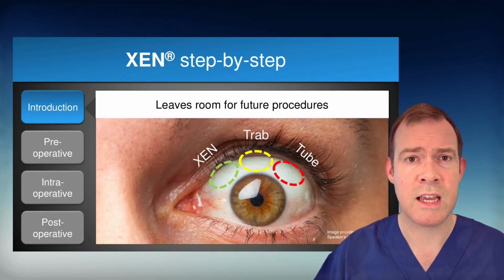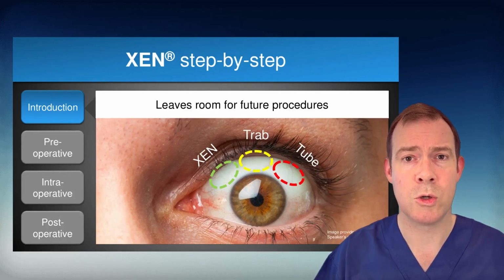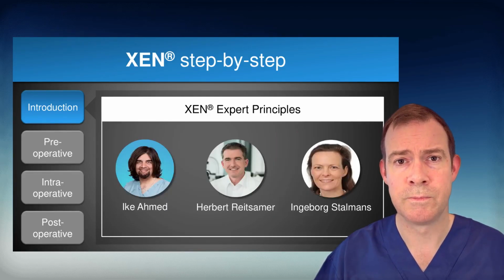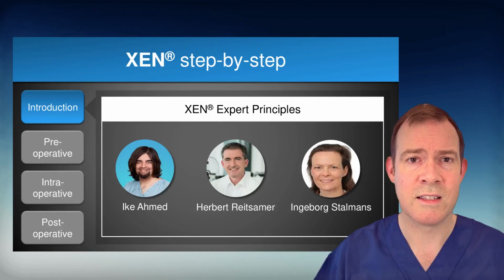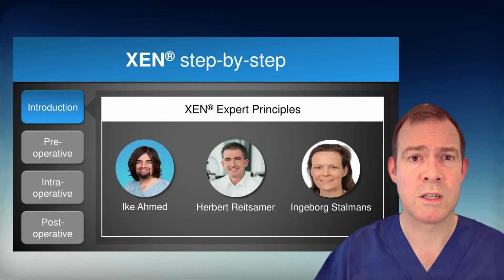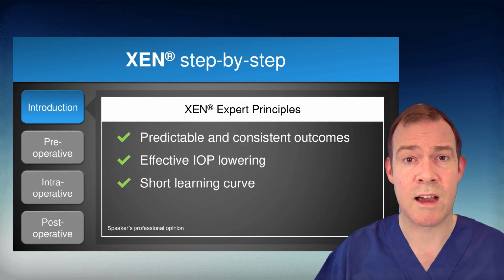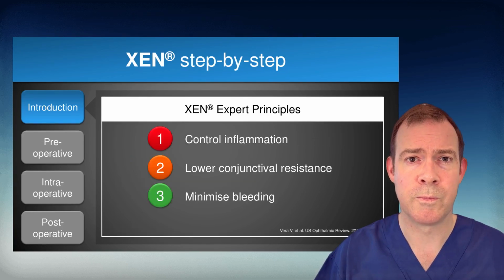One of the advantages of XEN is it leaves options for future procedures, like trabeculectomy and tube, should these be required. The goals of our surgery are to create a low diffuse bleb, which is posterior, comfortable, and efficacious. We can do this by applying the XEN expert principles, which were developed by Drs. Ahmed, Reitsamer, and Stalmans. These principles are designed to help provide predictable and consistent outcomes, effective IOP lowering, and to help shorten the surgical learning curve.